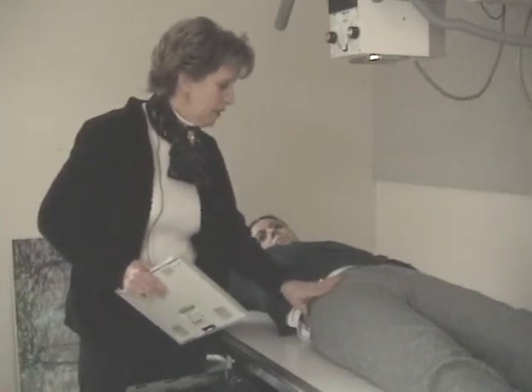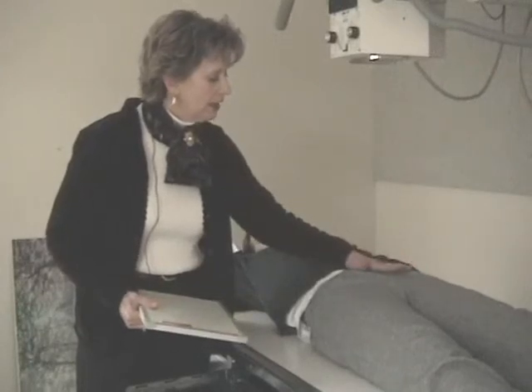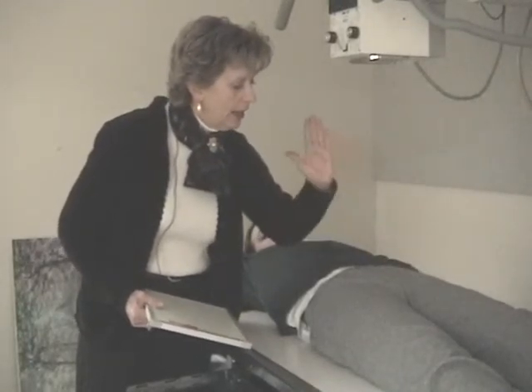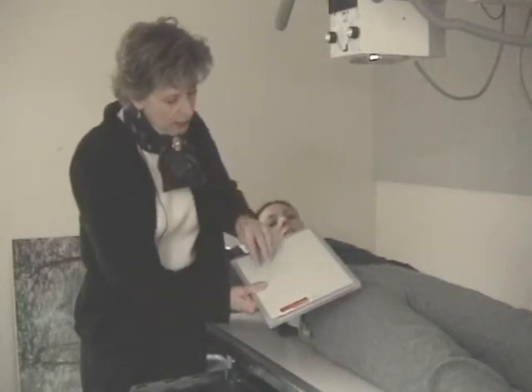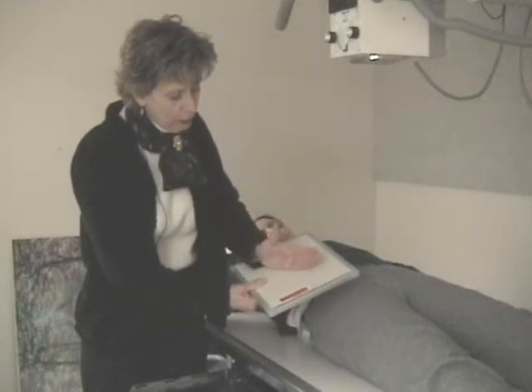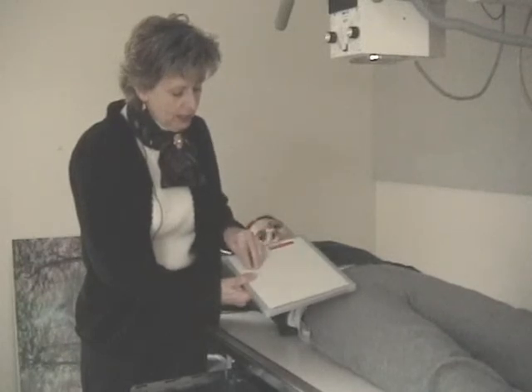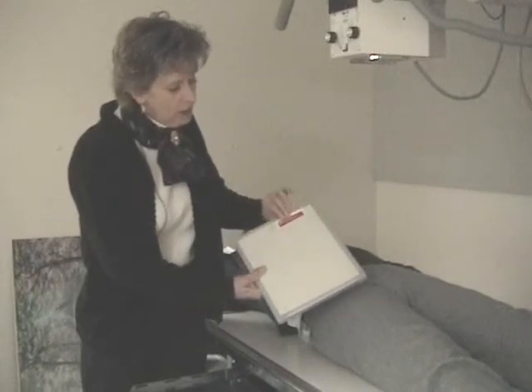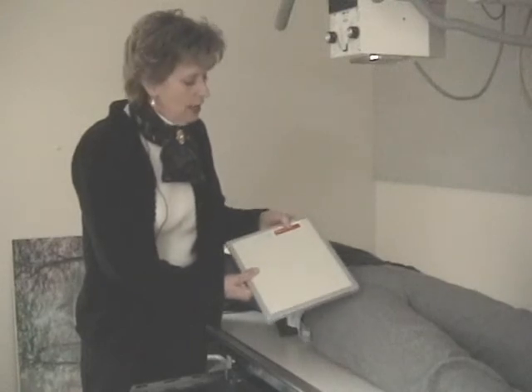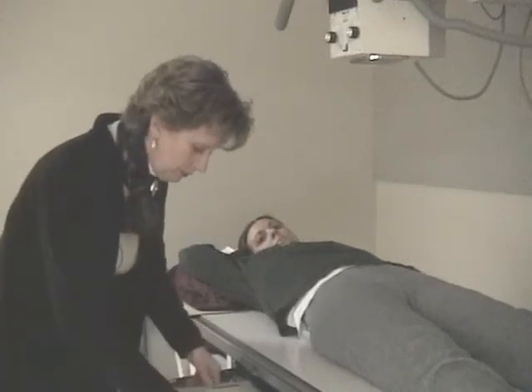I'm going to demonstrate. I think a left will be easier for the camera to see. Okay, so the left, I'm looking at the anatomy here, and here's the acetabulum, and the femoral shaft goes that way. So if I look at the cassette, here would be the acetabulum, and the femoral shaft would go that way. If the cassette was like this, here's the acetabulum, femoral head, and the shaft would go that way. So I'm going to choose to put the ID blocker to the top. It's not going to be in the way in either projection. And with it to the top, it's easier for the radiologist to read. So the film goes lengthwise.